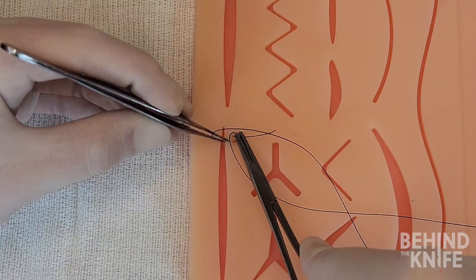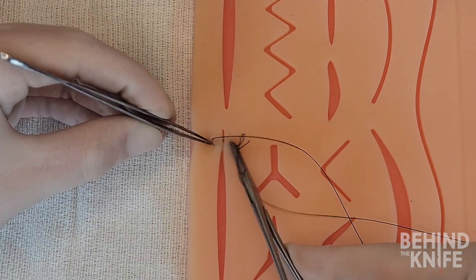Now you will notice that the suture is coming out on the opposite side of the wound than when we had started.